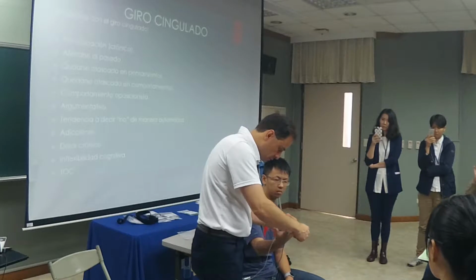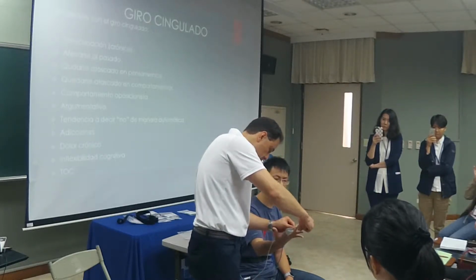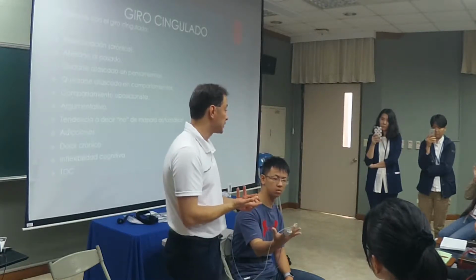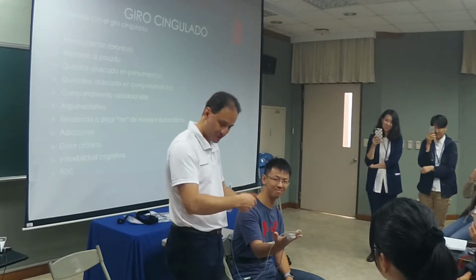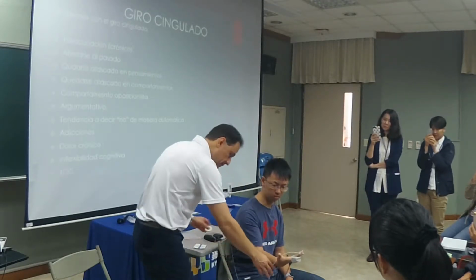The other thing is to make sure it's not too tight. How's that? It's not too loose, so it comes off, but it's not so tight that you cut down circulation. Then your hand is really cold, but there's no blood getting to it, because it's too tight. So that's good. I'm going to go ahead and tape it here. Can I tape it here? Okay.